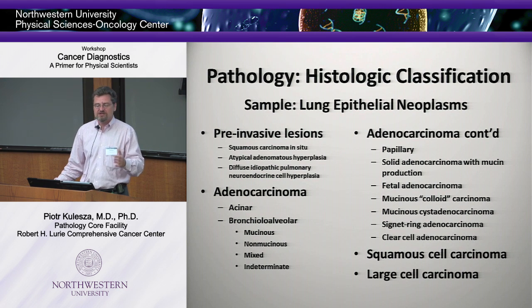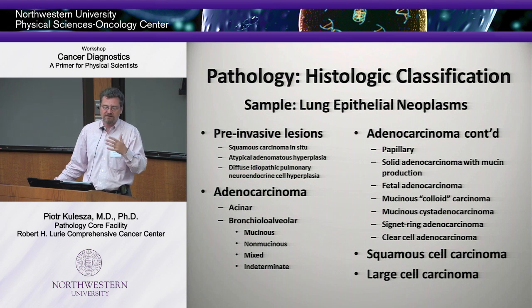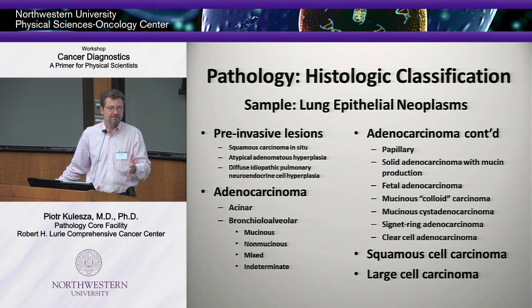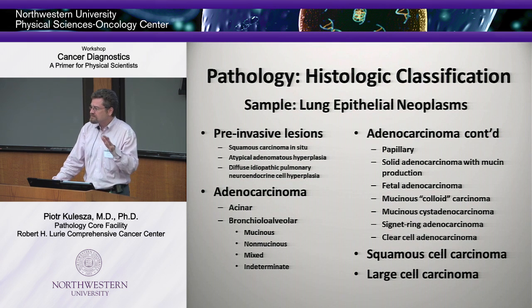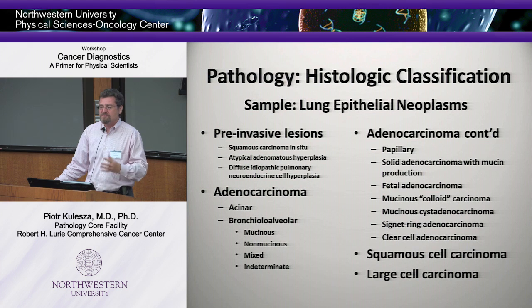They reflect a certain basic biologic truth about carcinoma. In this case, carcinoma is a malignant, epithelial malignancy, but cancer, a malignancy. They are consistent. This is how we classify them. This is how we know what we know. It's not just that we apply a name to this thing. It actually has a very deep meaning. Okay? Is that clear?